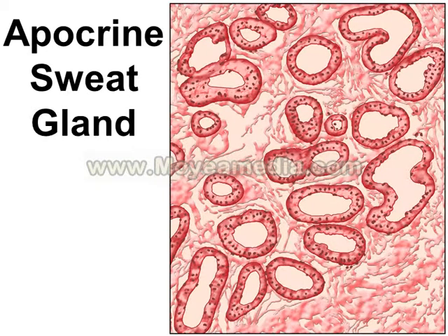Apocrine sweat is more visible and is fairly brightly eosinophilic, often noted within the lumens, not seen on this particular schematic. When not visible, it looks like this schematic where you have very large soap bubble-like lumens.